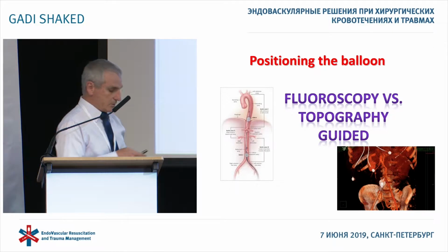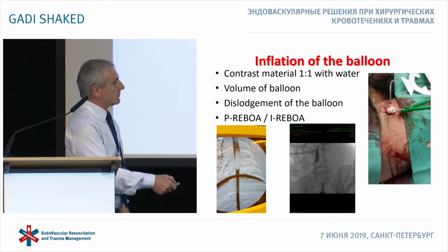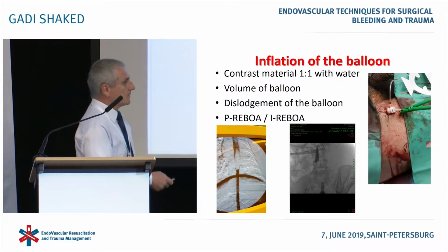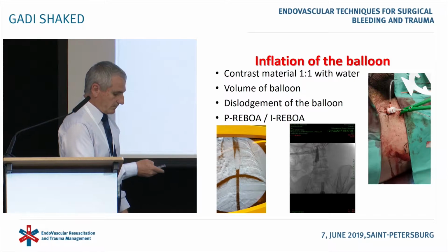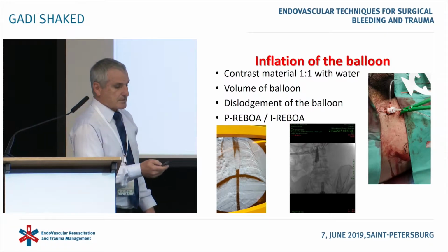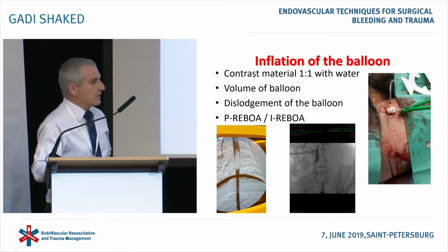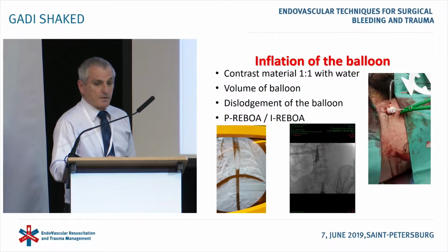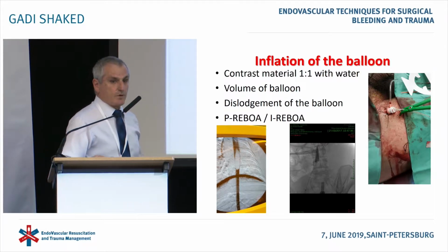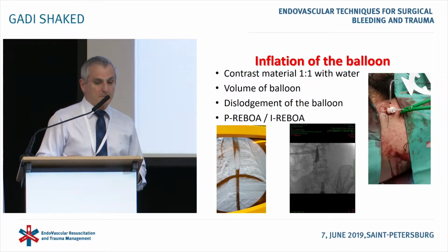The result was, anyway, a pseudoaneurysm in the iliac artery. So you have to be very accurate at the point of insertion.